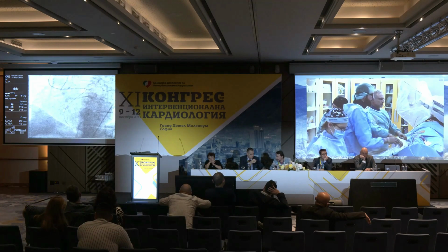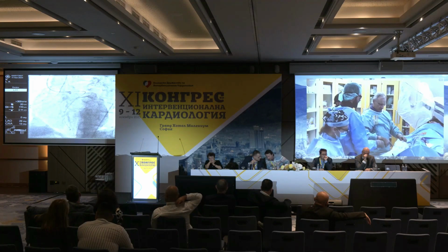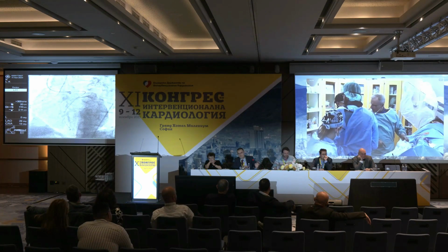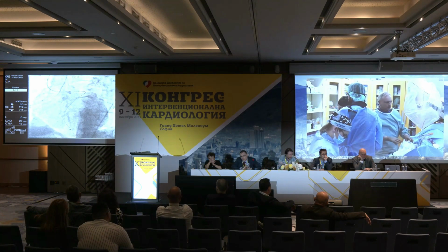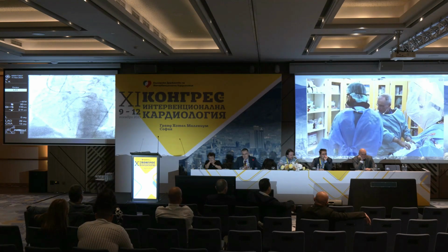We don't need that much. I will do it manually for you. Can we start? We are recording. Ah, you're recording. Okay. All right. Okay. No, I will do it manually.